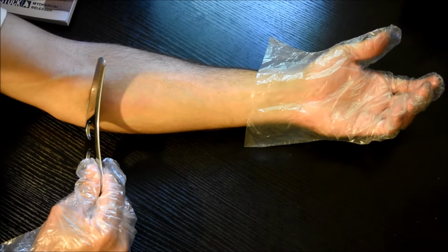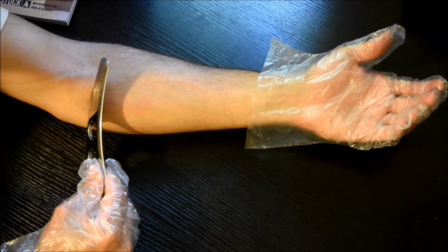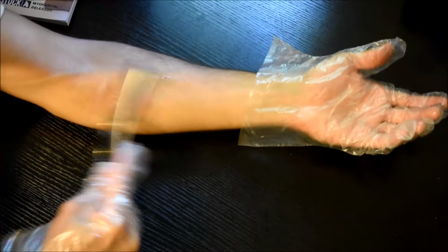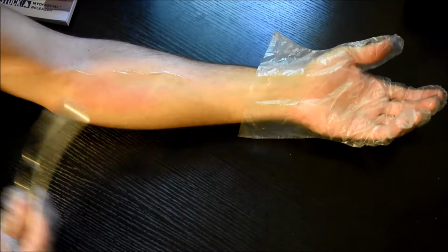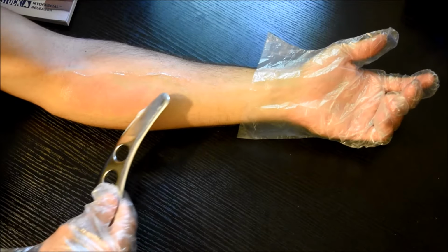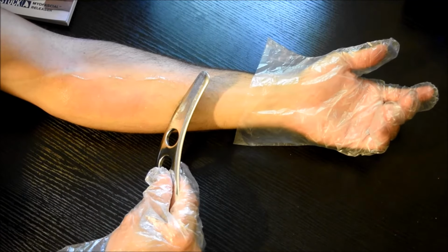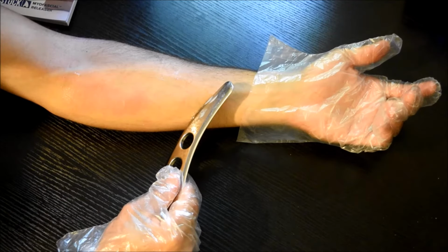I'm going to do about 20 to 30 strokes, and you're going to go at about 180 strokes per minute, or about 3 per second. So here we go. 1, 2, 3, 4, 5, 6, 7, 8, 9, 10, 11, 12, 13, 14, 15, 16, 17, 18, 19, 20, 21, 25. So I did 25. You see how it's nice and pink? That's pretty good. Now I'm going to move to the distal area here. Again, I'm going to go distal to proximal, 45 degrees, 3 strokes per second, and I'm applying about 4 pounds per square inch.